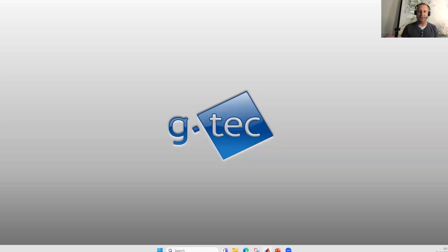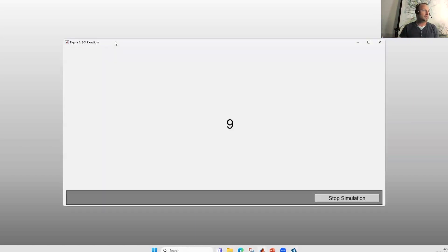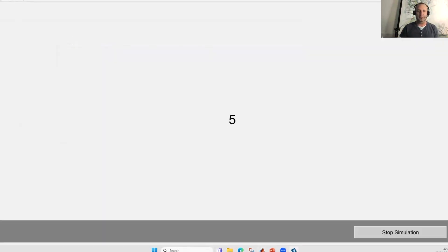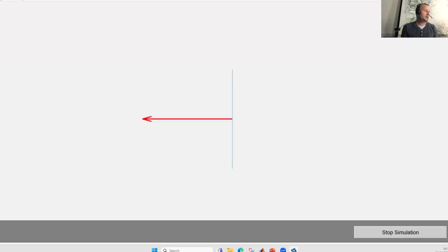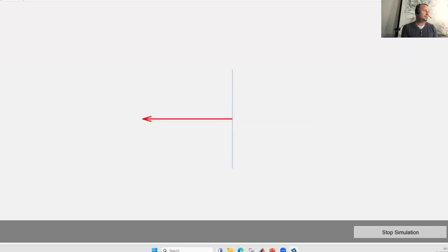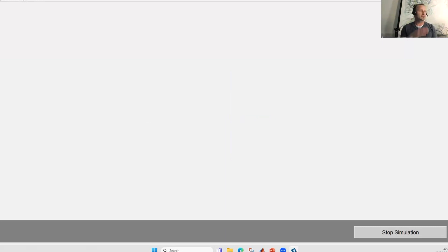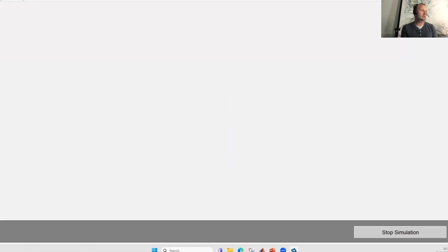The stimulators are doing a self-test again. The paradigm is shown. I activate the FES. Now we see we get a bar feedback — this is the real-time feedback from the classifier. When he's imagining the right-hand side, for example, now it's wrongly detected — it was right-hand but it was a left-hand task. Now it's correct and we are getting the feedback through the FES.